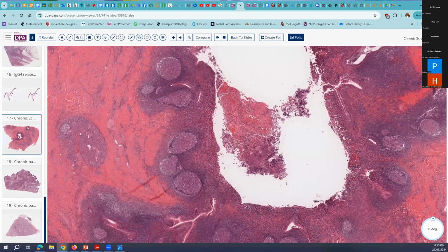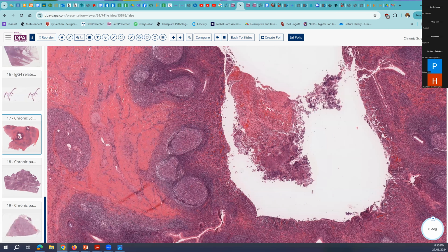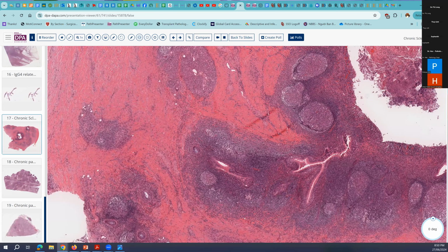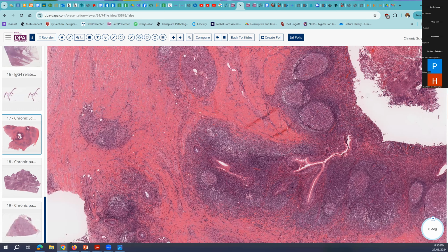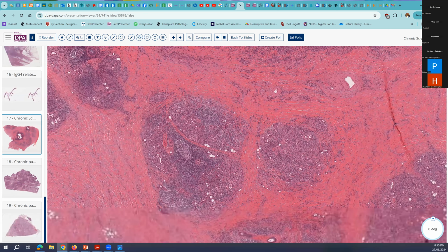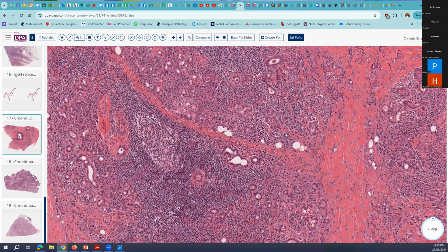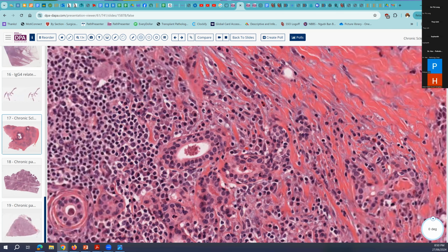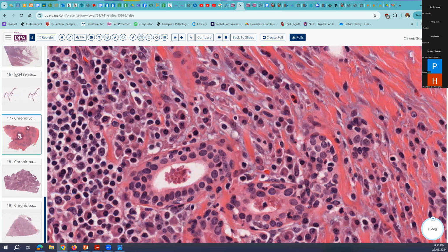And that's often the backdrop, a long-standing chronic sialadenitis. And then they develop a rock-hard mass, and you think it's going to be cancer. And so the surgeon takes it out, and this is all you find, a very dense fibrosing process, a lot of lymphocytes and germinal centers in the acinar tissues. And you can see that here. And then as we come into higher magnification, I think you should be able to see that, well, guess what? We have lots of plasma cells here, and we've got our friend, the eosinophil.